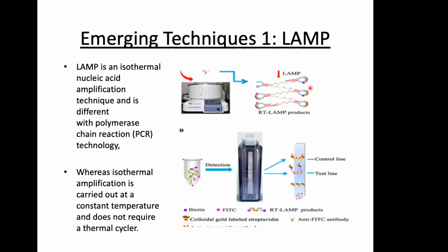And it requires the design of a few primers, loop primers. Okay, I'm not really a microbiologist, I'm a chemist. So the most important part is to design the LAMP primers. We have to design 5 to 6 primers before we can have this technique done. So this LAMP is possible to replace the RT-PCR.